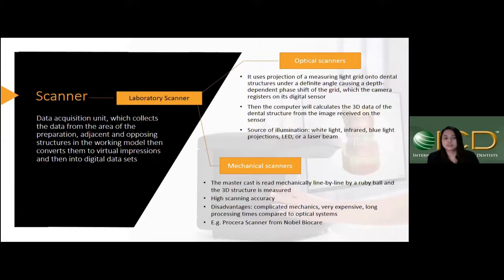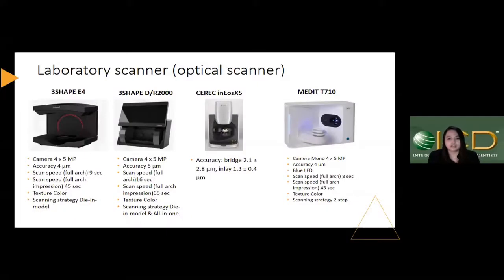For the laboratory scanner, we take impressions in the mouth and then pour a model, and then we scan the model in the laboratory using the laboratory scanner. These are examples of laboratory scanners, which are optical scanners. There are several brands.